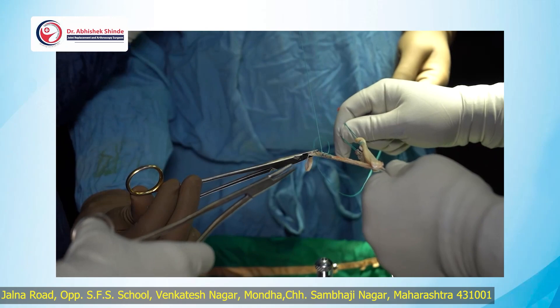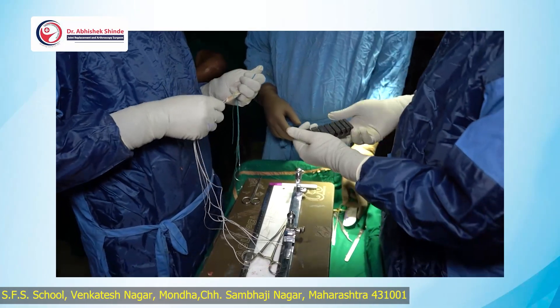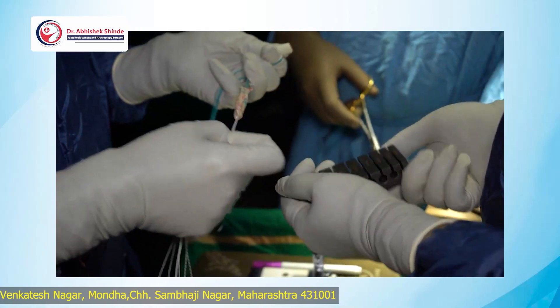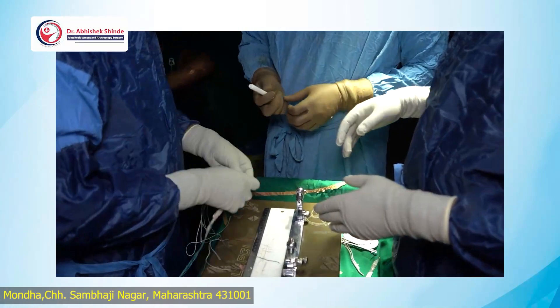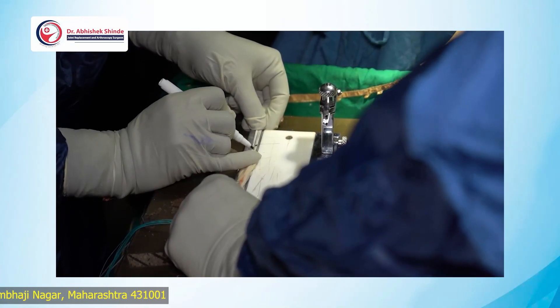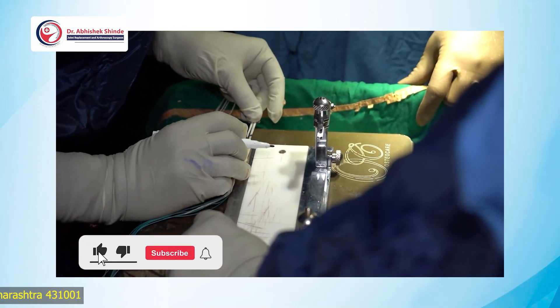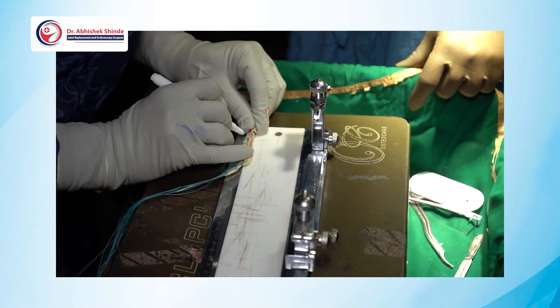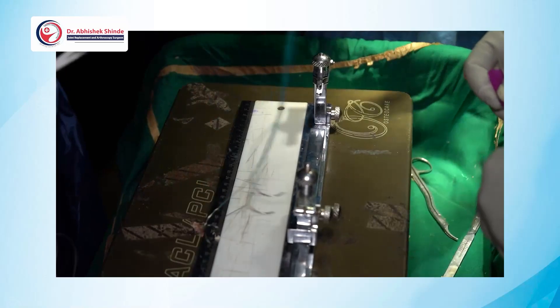Once that is done, recheck your diameter — it is snugly going through 8 mm, which is the best. Now how much graft you want through the tunnel: you have to mark two points on the adjustable endo button — one at the femoral tunnel length, which in this case was 40 mm, and then how much graft you want into the tunnel, which is about 20 mm. Doing ACL or PCL is just like solving a math problem once you've marked everything.